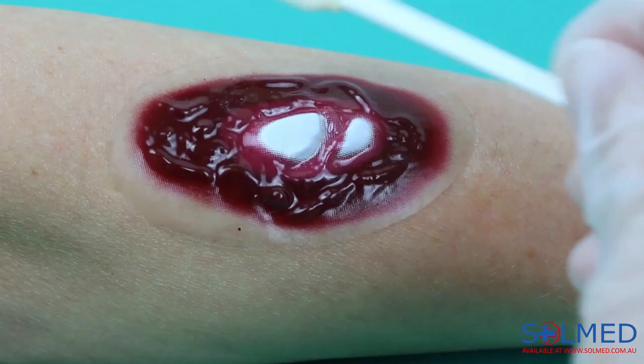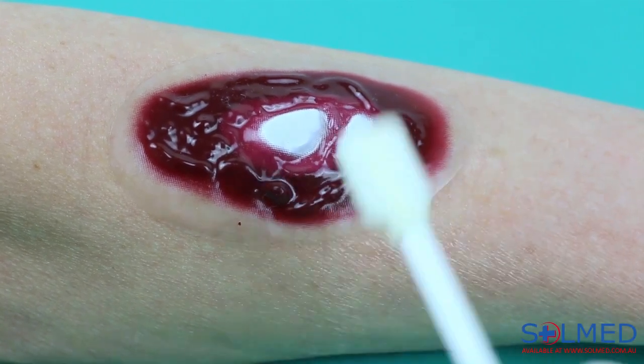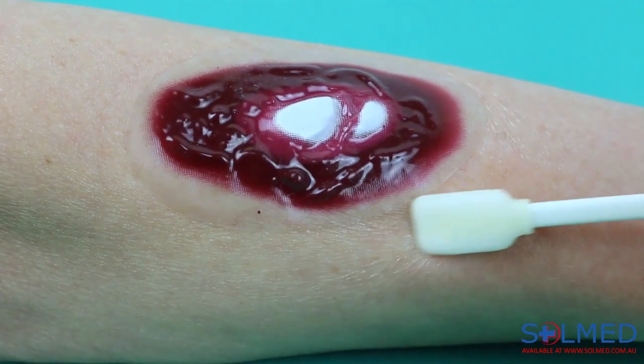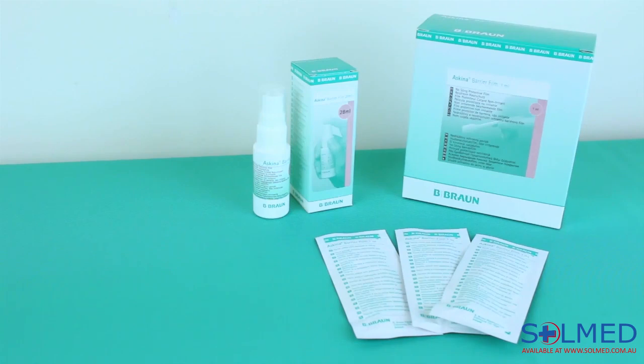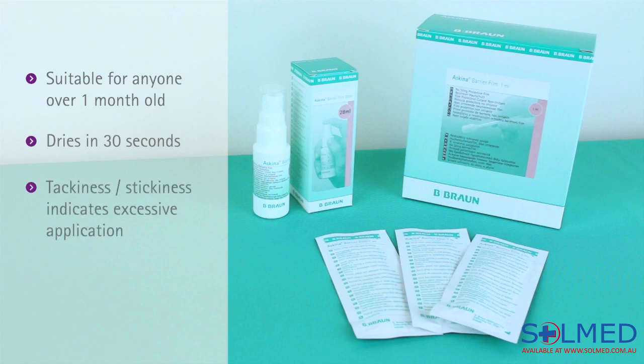The swab version provides a more accurate application and has a surface coverage area of 10cm by 10cm. Skeener Barrier Film is suitable for use on anyone over the age of one month. It dries in 30 seconds, and if it feels tacky or sticky, you have applied too much — a thin layer is all that is required to provide protection.